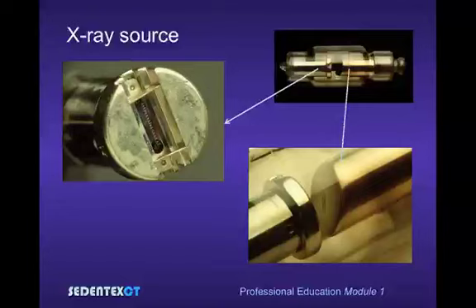At the other end of the X-ray tube is the anode, which is made very positively charged by the kilovoltage across the X-ray tube. The result of this is that the electrons produced at the cathode gain an enormous amount of energy and pass rapidly across the X-ray tube and hit the target on the anode. This produces X-rays, although in fact most of the energy is converted to heat. This heat is conducted away down the copper of the anode.